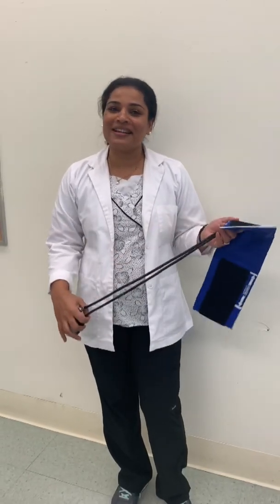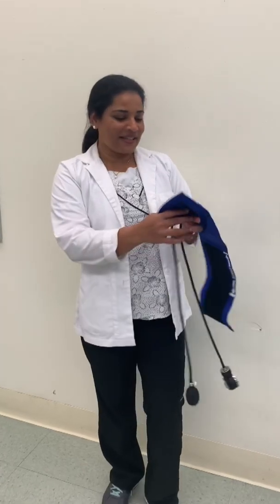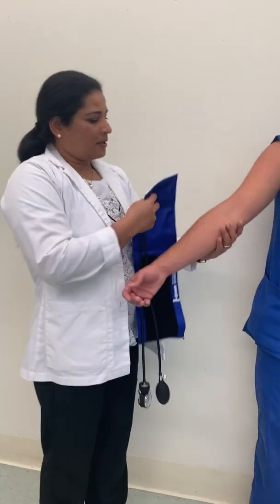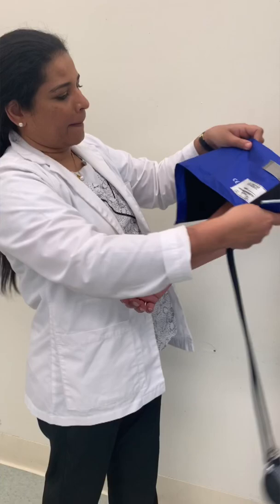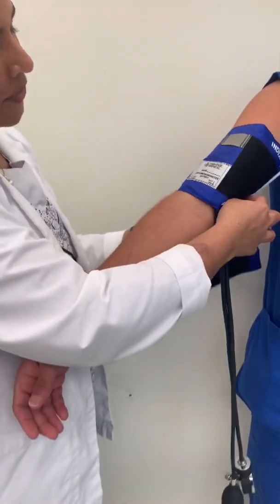Hi everyone, today I'm going to demonstrate how to take the blood pressure in a two-step technique. First thing, you have to check your blood pressure cuff for the right size. Then you apply this blood pressure cuff two inches above the elbow and wrap it.